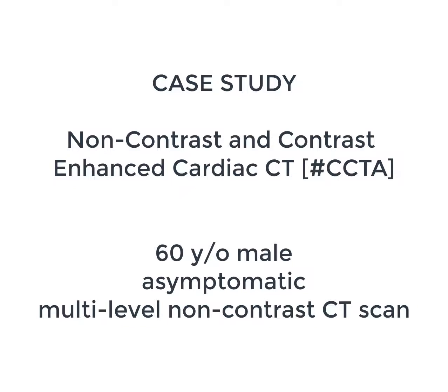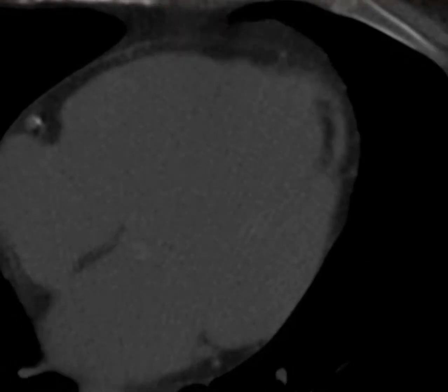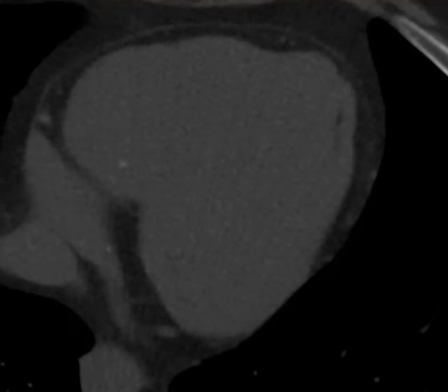This is an absolutely fascinating study of non-contrast and contrast-enhanced CT, looking at a 60-year-old asymptomatic individual undergoing a multi-level non-contrast CT scan. Look at the arrow. As you go down through the individual slices, you can see an oblong-shaped area of very low density that appears to have normal epicardium on the other side of the region.